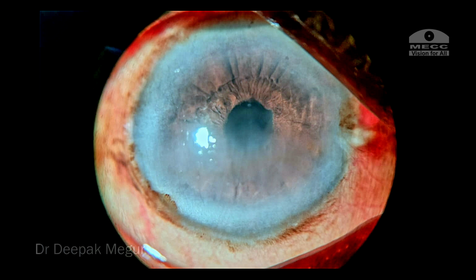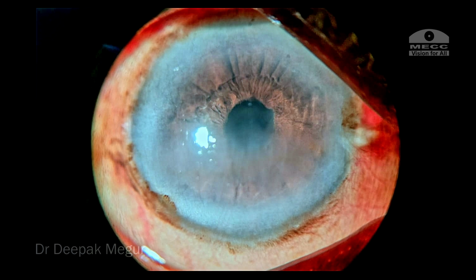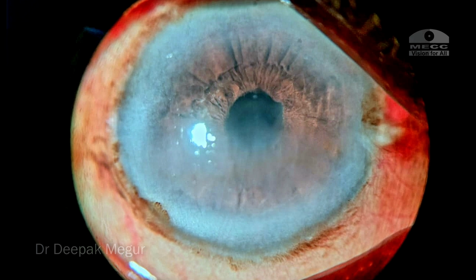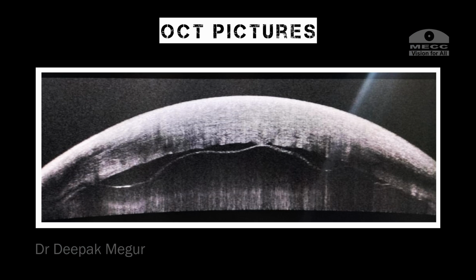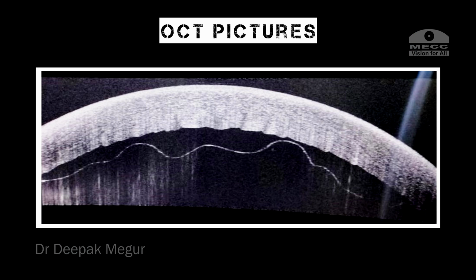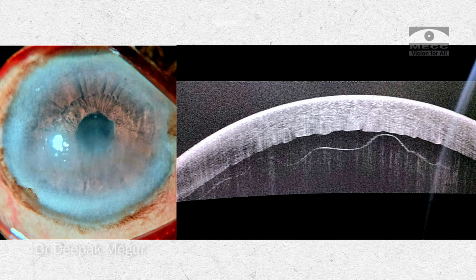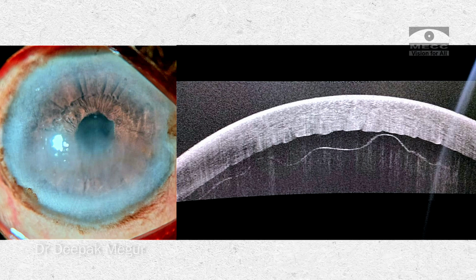This is a case which has a post-operative corneal edema on the first post-op day. It was operated by a resident doctor and it was presumed that over a period of time it would clear. But on the fourth post-op day, the edema still persisted. So an anterior segment OCT was done and it showed an area of detachment in the inferior half of the cornea corresponding to the area of corneal edema. The detachment was quite large and it deserved attention.